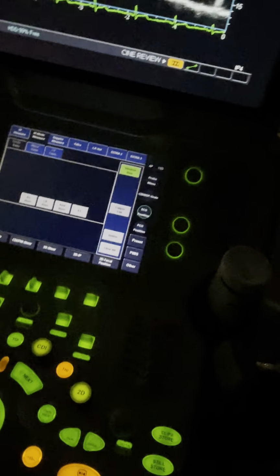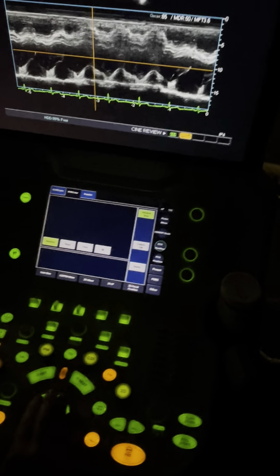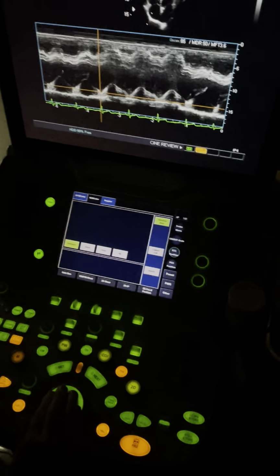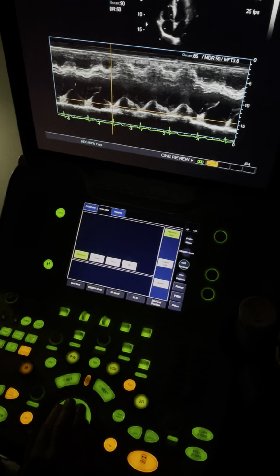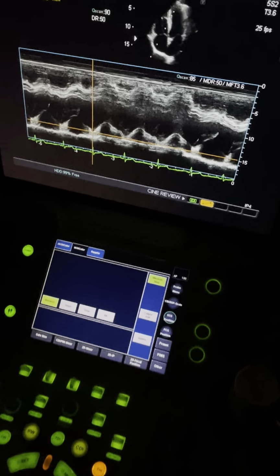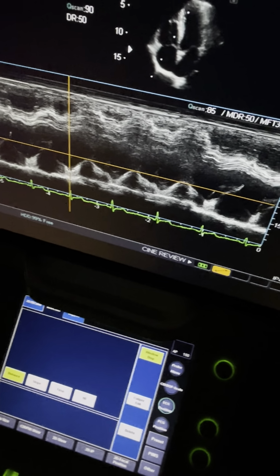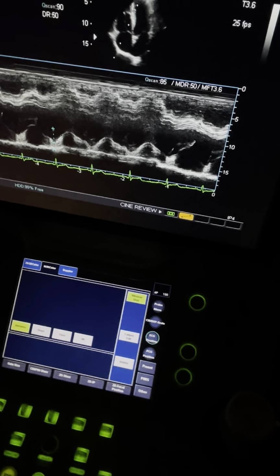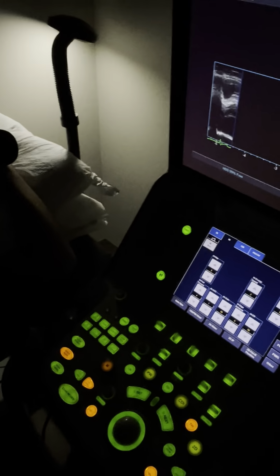Where is caliper here? Right there. Here you go. This is what happens. About halfway through a machine, your brain flips, so I have to relearn it. So I'm going to come down to the trough, go up to the peak. We're good. He's normal.